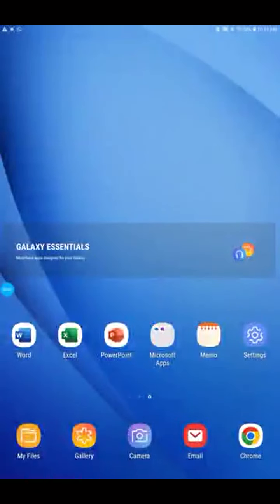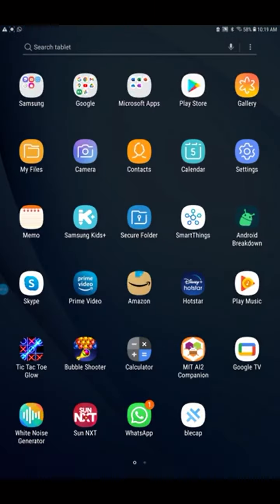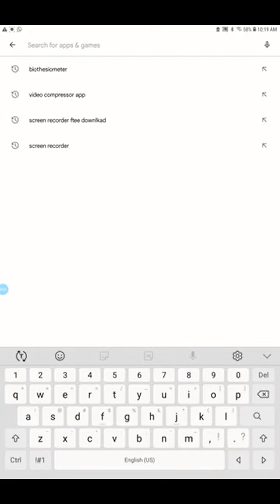Our Vibrometer with an Android mobile or tab application. First you have to install the application in your mobile. So for that you have to go to the Play Store and then search for Biothesiometer. Since I searched already, I already got this, so I am selecting it, but you have to type it otherwise.